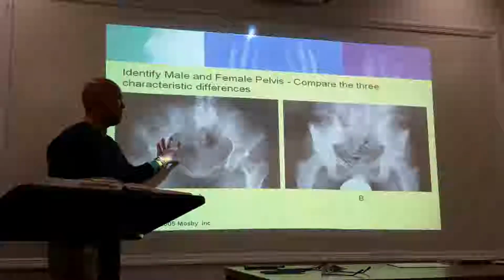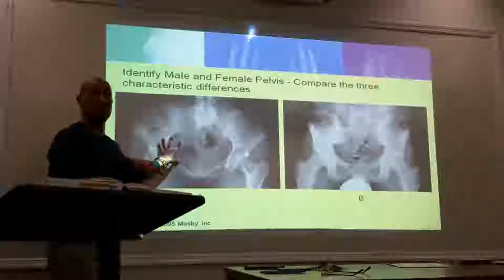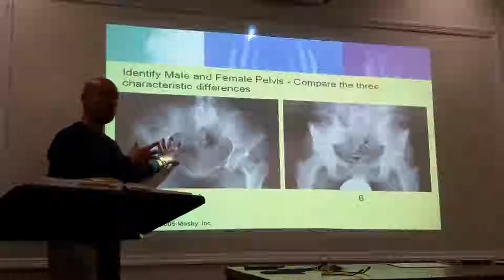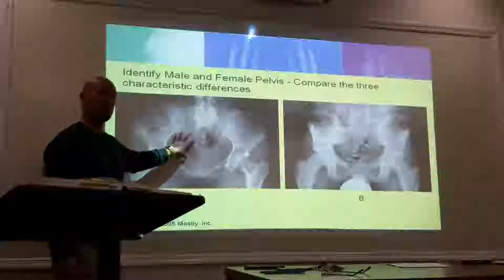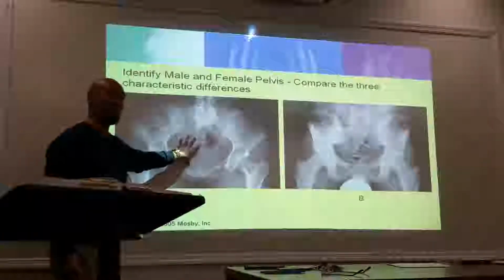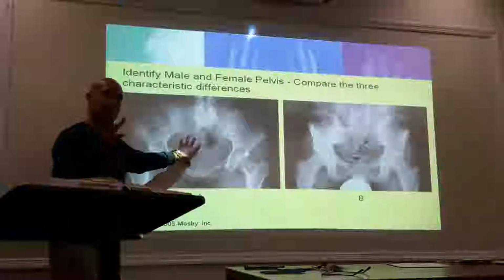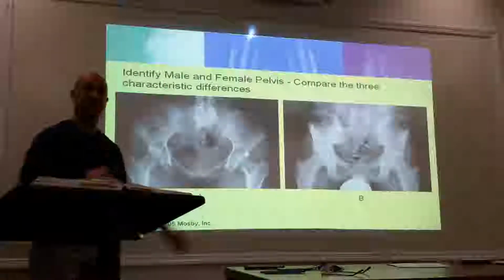If it's routine, we'll say NPO after 7 o'clock, and we'll see you the next day. We've got to make sure that your bowels are empty. We want you to go to the bathroom before you come and take your x-ray, and then we'll shoot it this way. So the bladder should be empty. Now the AP view is not always going to be the good view. Then we'll do a lateral, which is more telltaling, no pun intended, because it's projected from the rest of the anatomy.